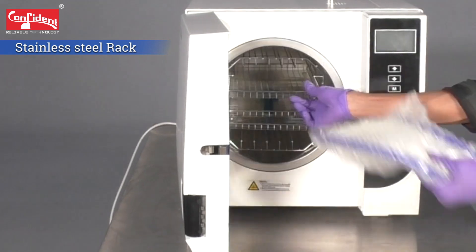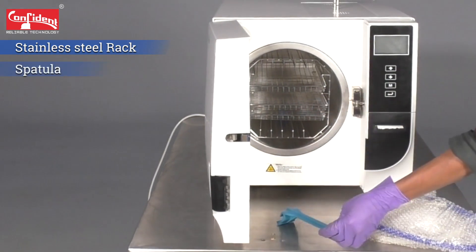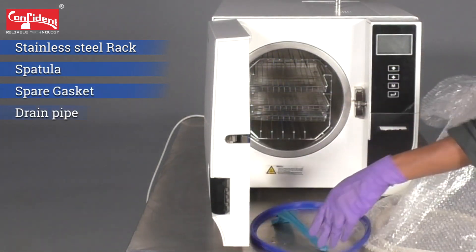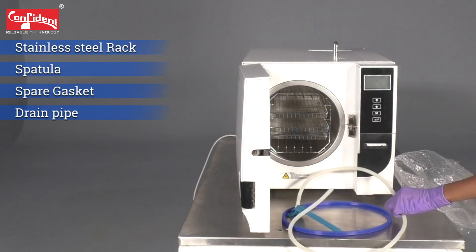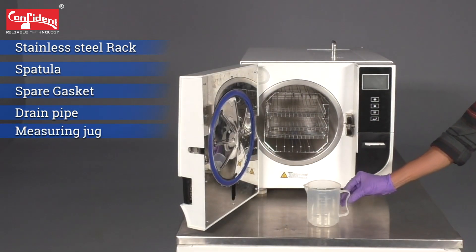The device comes with a stainless steel rack with three trays, a spatula, a spare gasket and a pipe to drain the water. It also comes with a measuring jug.